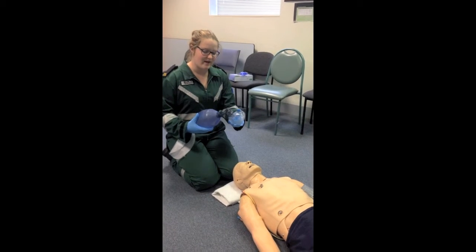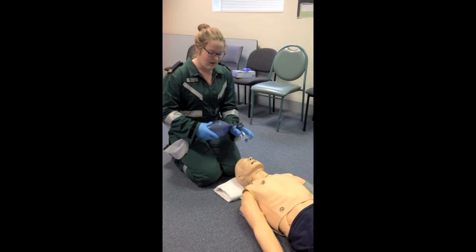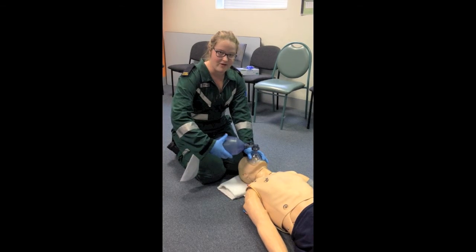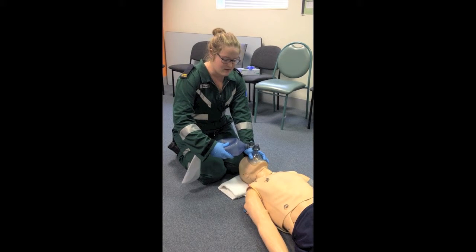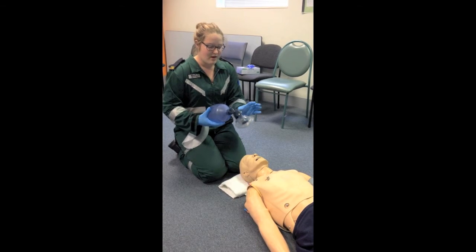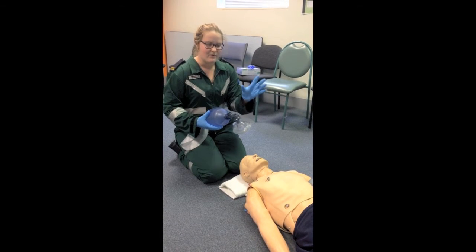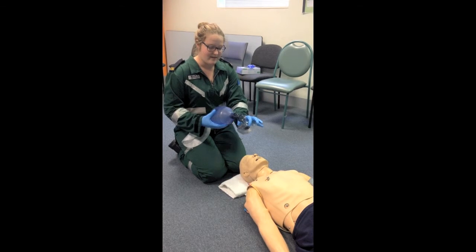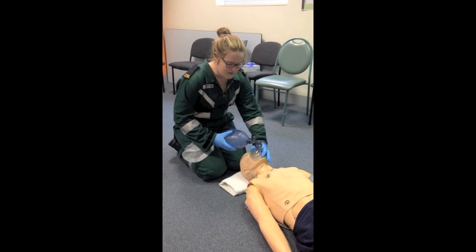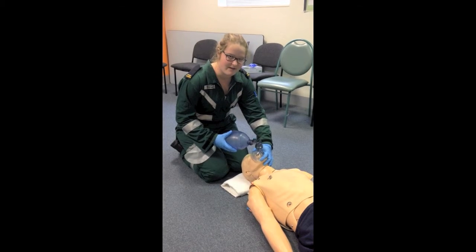A common error of the bag valve mask is to overventilate the patient. So you squeeze too much air into their lungs, which causes overinflation. To do this correctly, you need to gain a correct seal by using the C grip with your index finger and thumb and placing that around the top of the mask. So you put that over their mouth and nose, and then you put the remaining fingers under the chin to get a good grip.